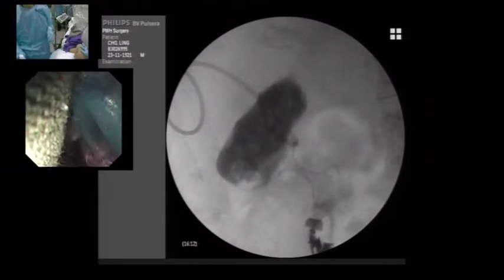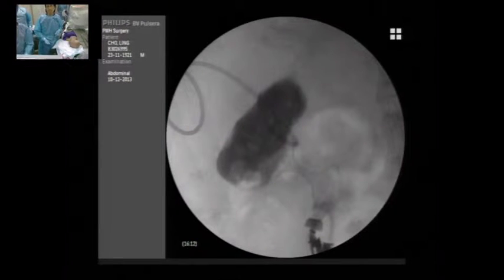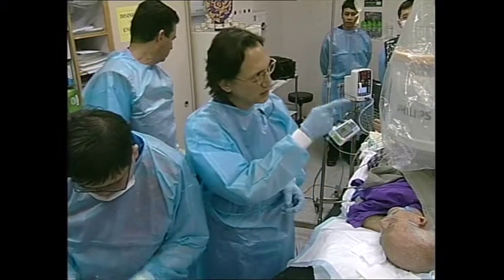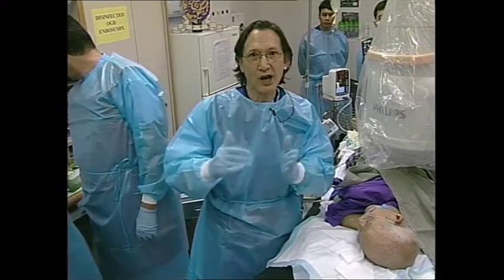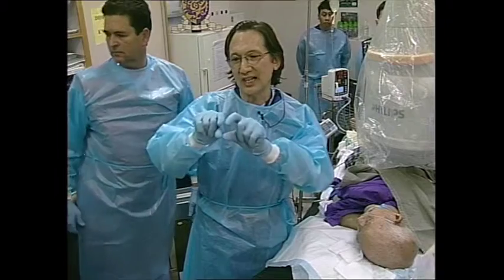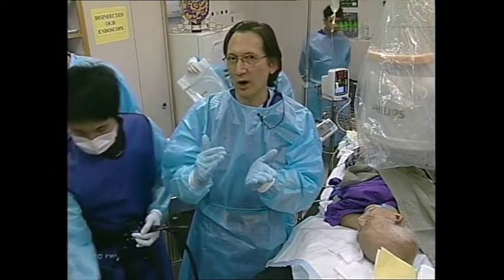Is this a minimum or maximum diameter between the gallbladder and the duodenal wall for you to do this drainage? Is that maximum? Yes, 1 centimeter. 1 centimeter, just like pseudocyst, is very generous. Remember when Anthony measured out the distance before, it was about 4 millimeters, right? Yep. But on EUS, it looked like a big gap between the duodenal wall and the gallbladder wall, and you could see that echogenic tissue. That's fatty tissue that is in between the two. So those two walls are not fused together.